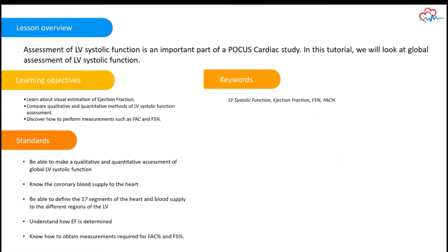The learning objectives are as follows. This video covers how to make a qualitative assessment of global LV systolic function. Additionally, three quantitative methods of LV systolic assessment are shown. These are fractional shortening, fractional area change, and EPSS.